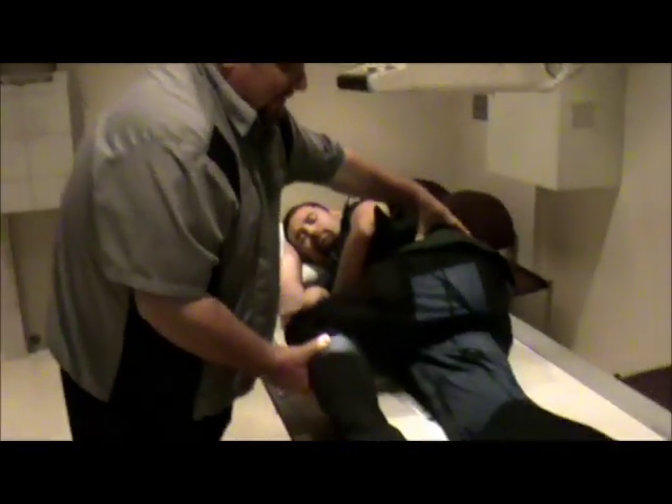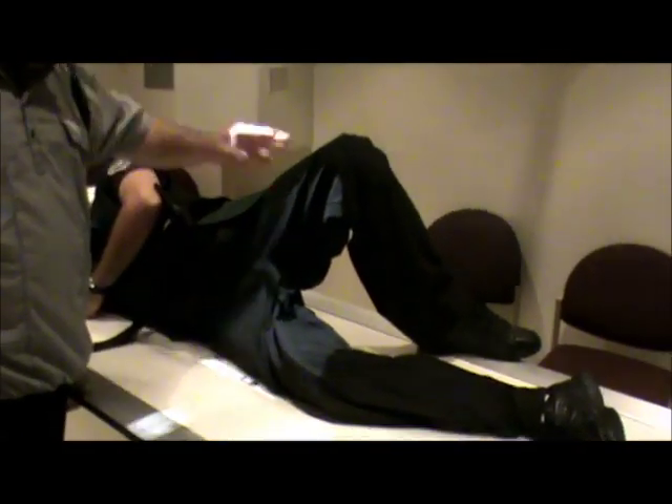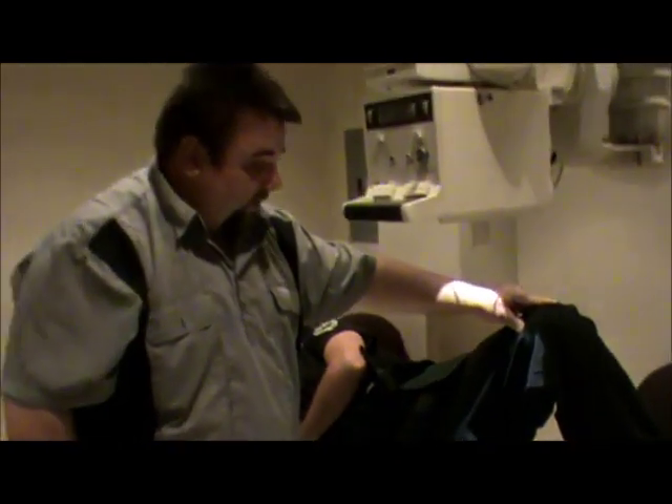You can also have the leg back — you can do it that way. But I think, as long as you're careful, you can actually get more of the femur with the patient having the leg over. The key is: don't over-rotate the leg. These are your femur x-rays.